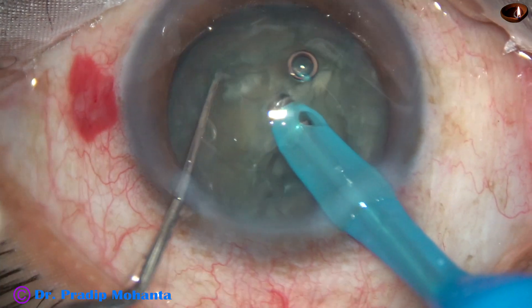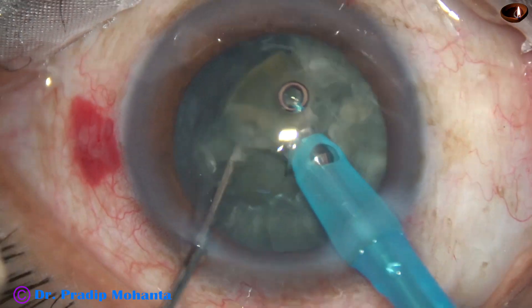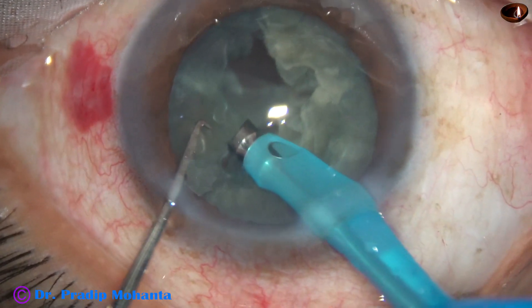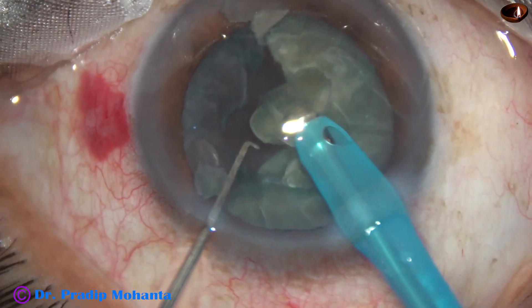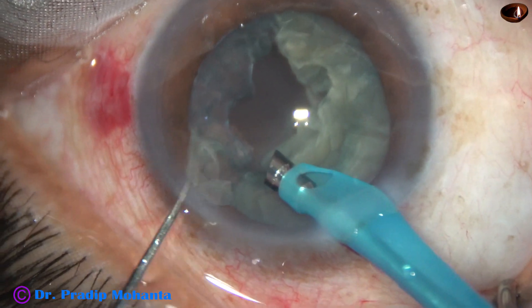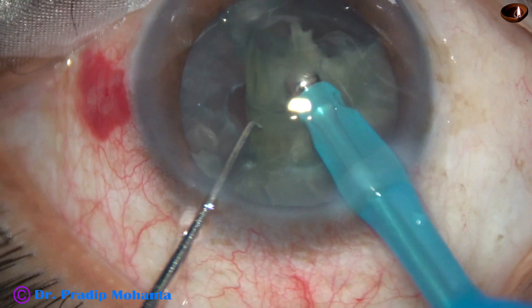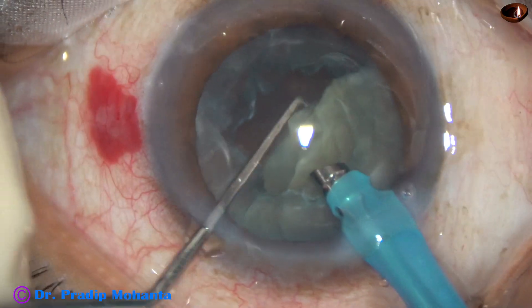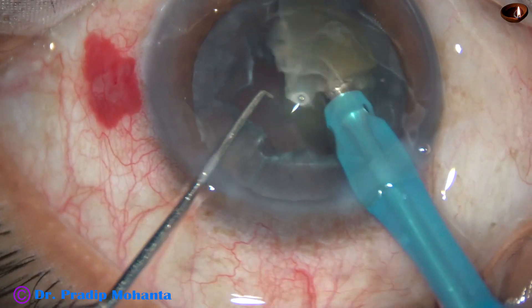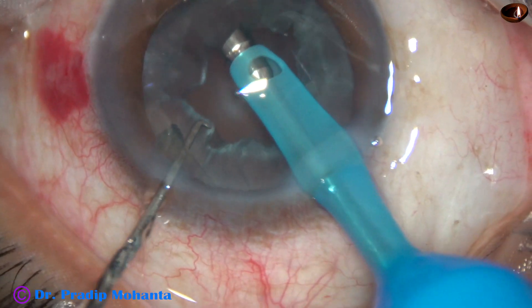The tip is buried into the substance of the nucleus, ensuring adequate depth. The lower part of the tip is at about 4 millimeters deep — we have removed some superficial cortex of about 1 millimeter, going into the rest of the nucleus. We get a depth of about 3.75 to 4 millimeters, which is enough to have a nice hold and to facilitate dividing the nucleus into several pieces. This hemi-nucleus has not been rotated — it has been tilted and divided into two pieces and removed.